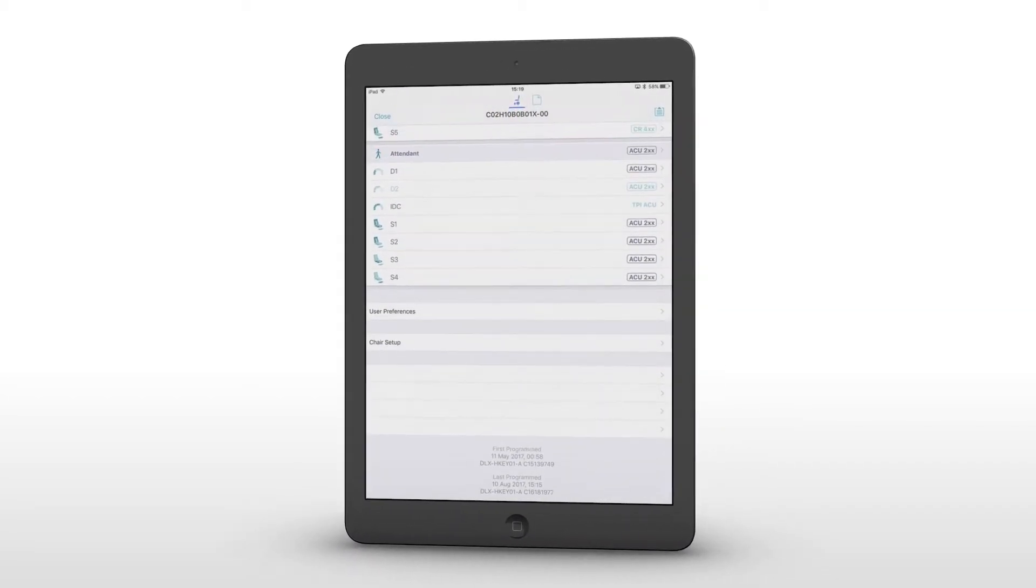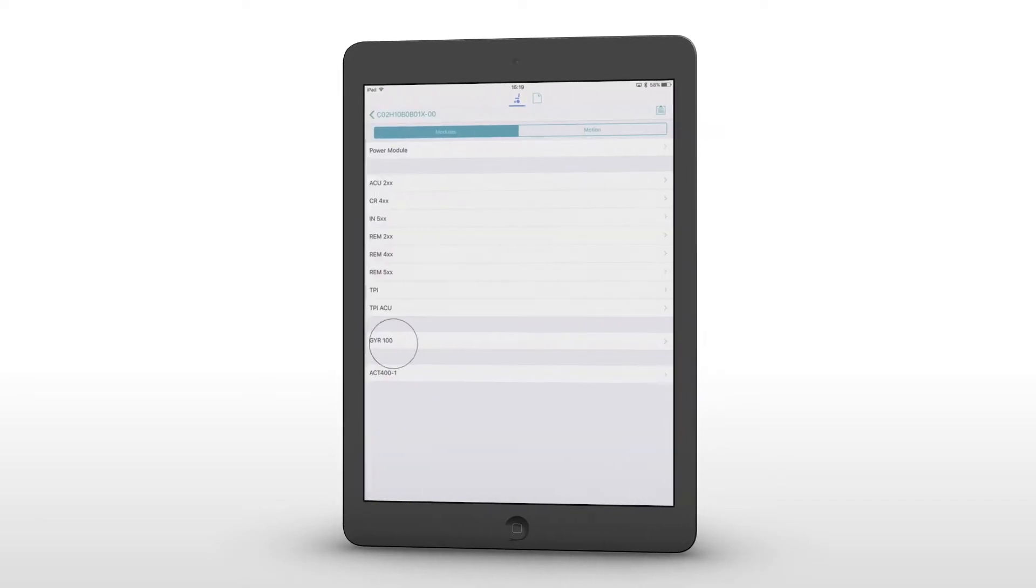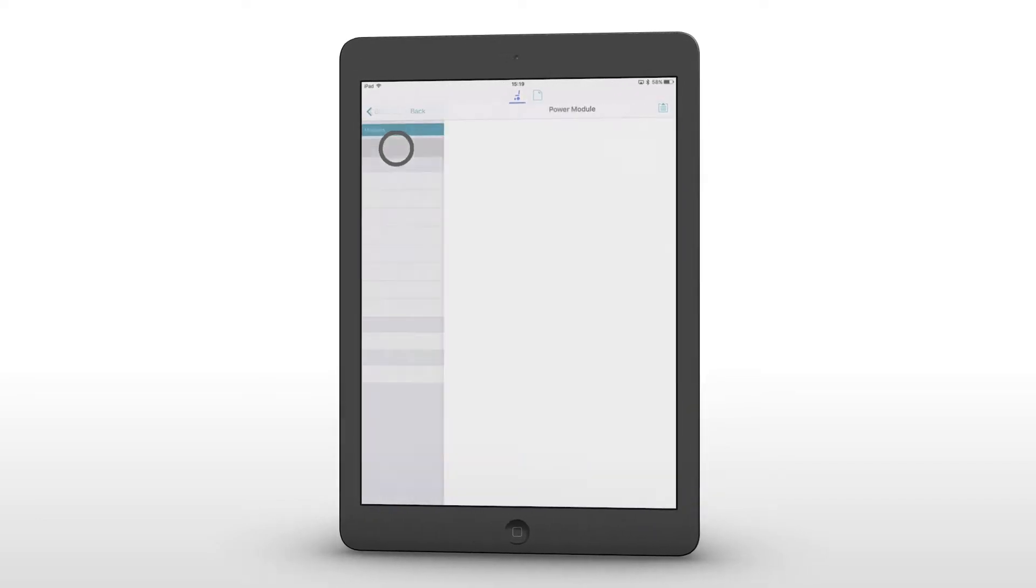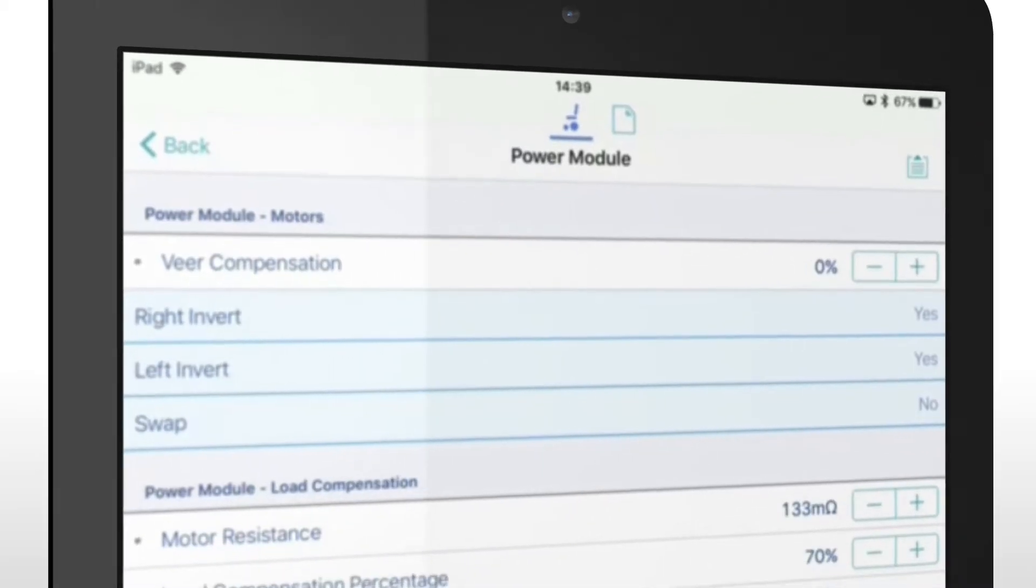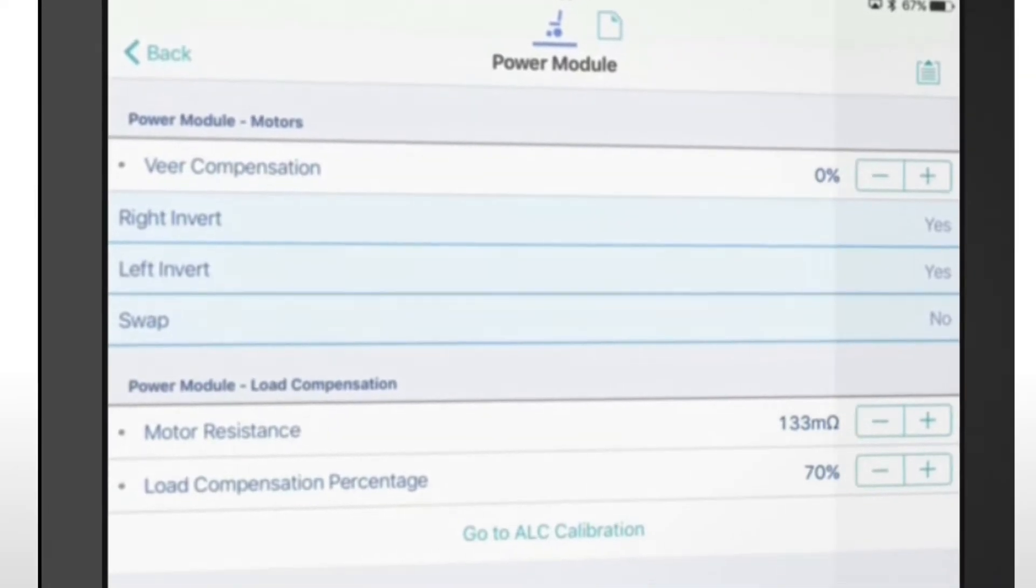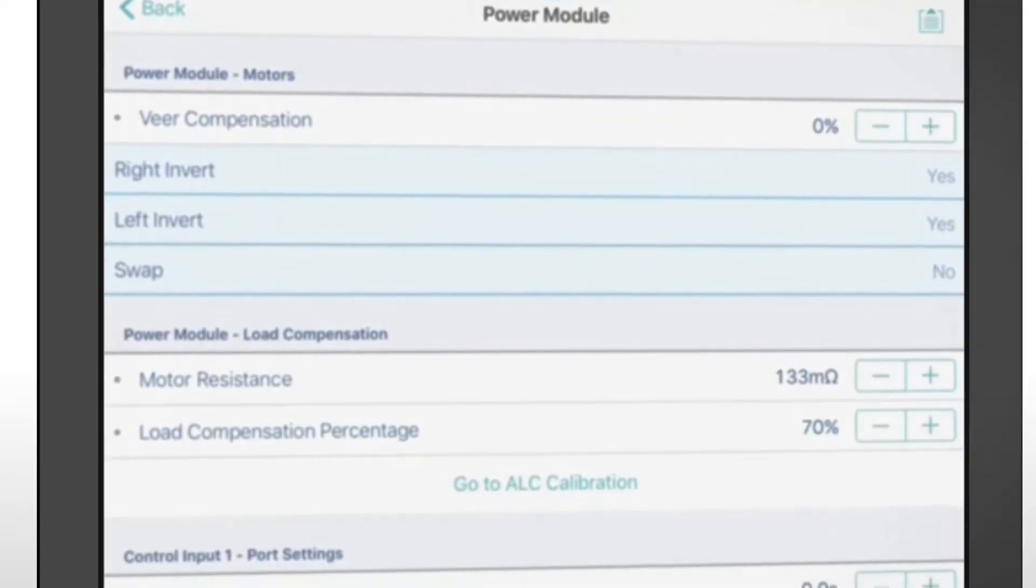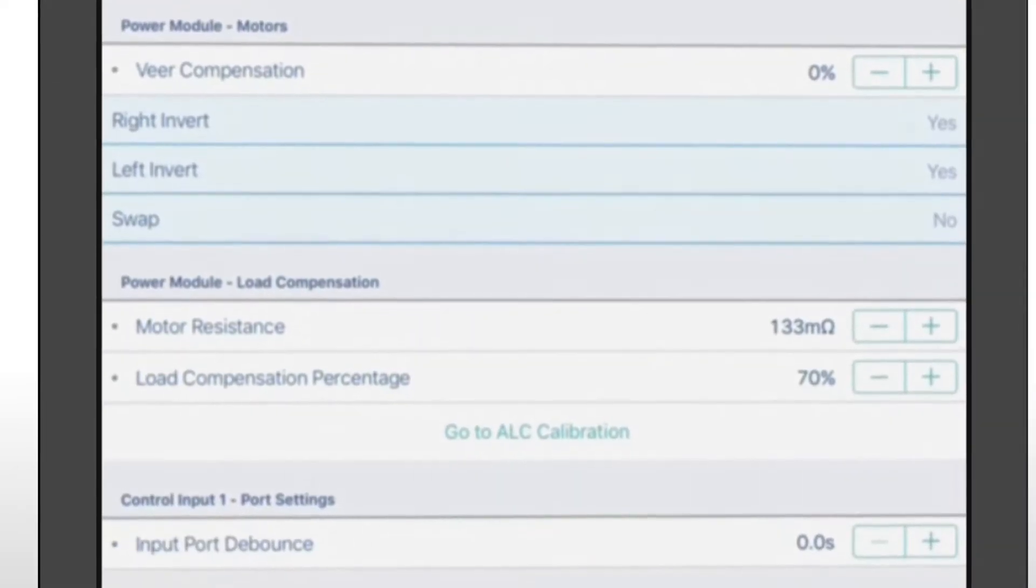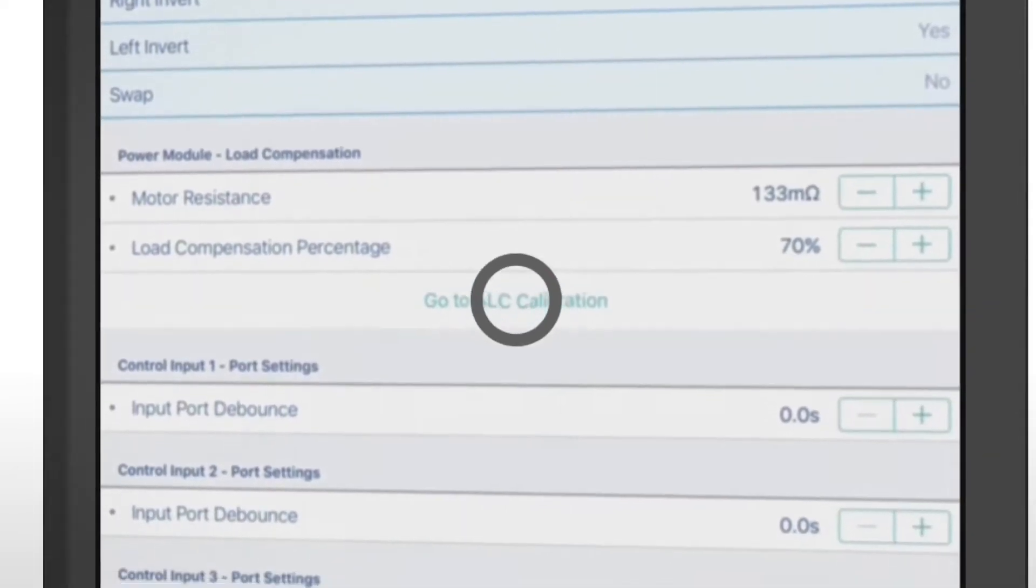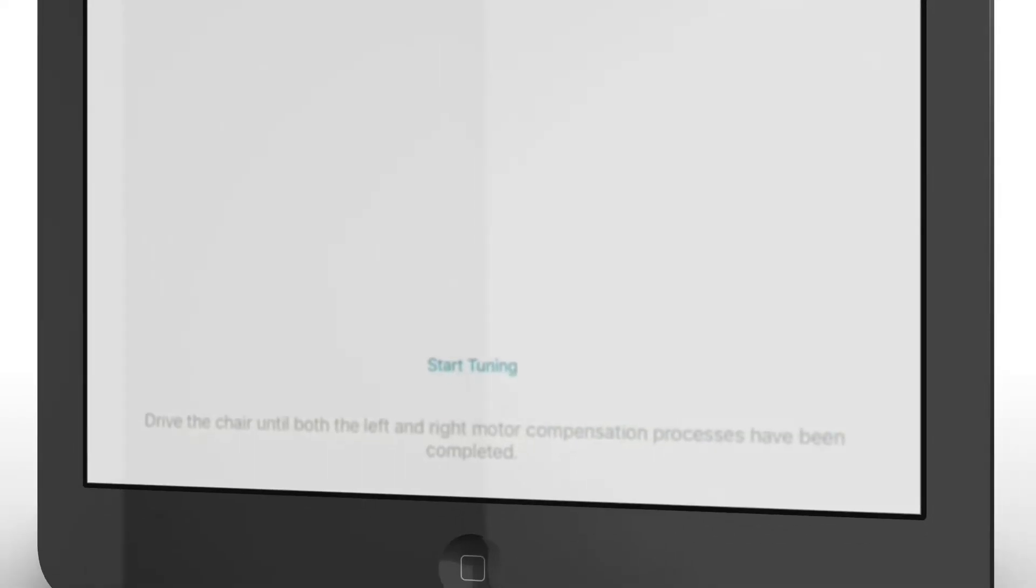Simply select chair setup and power module. Adaptive load compensation calibration is located at the bottom of the screen. Selecting this function starts the calibration tool.